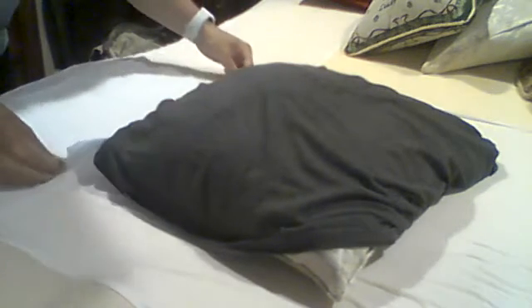So next, the first thing that I'm going to do is place my supplies on a clean surface. So I have this clean surface right here, and I brought with me a pad that I can use to place some of my stuff on. So I'm going to go ahead and place that down. And then I'm going to go ahead and place down my tools that I'm about to use. Alright, so I have those down.